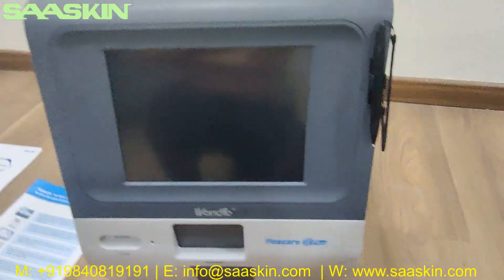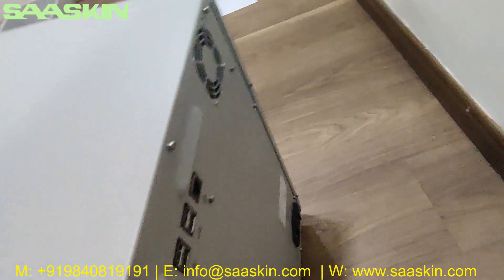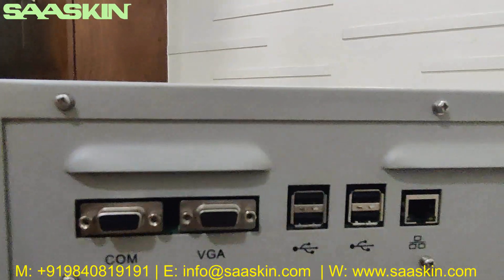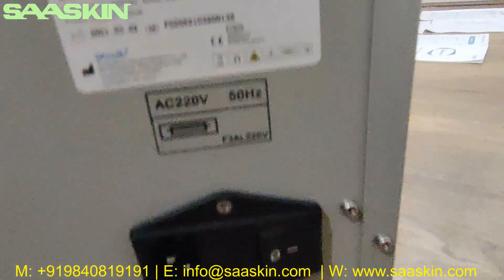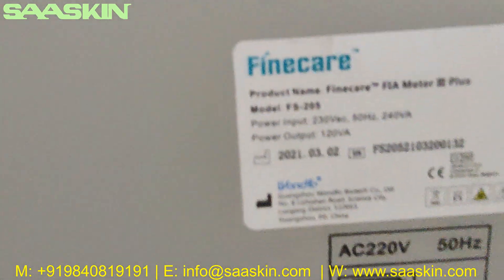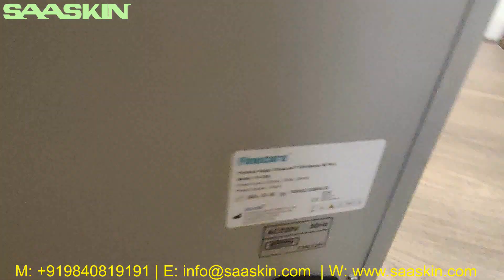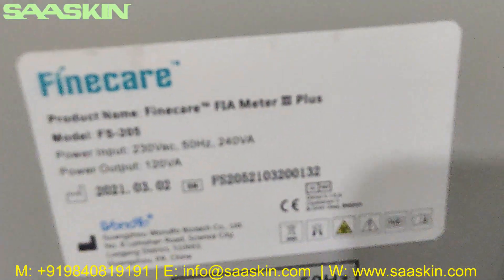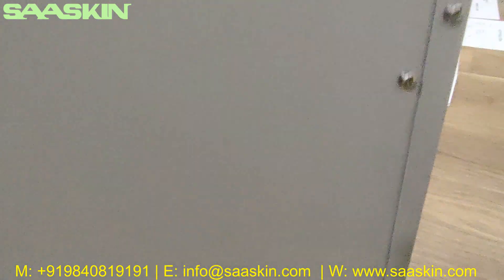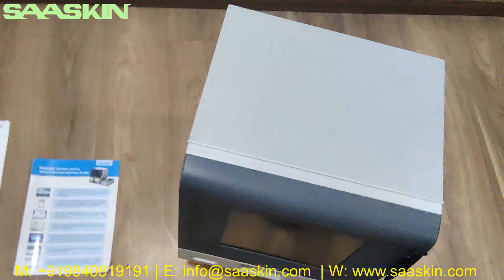The machine has a pen tray on it, as you can see here. I'm now showing the backside of the machine. On the back you can see there is a power cord connection. The label reads Fine Care FIA Meter 3 Plus, model FS205. This is how the total machine looks.